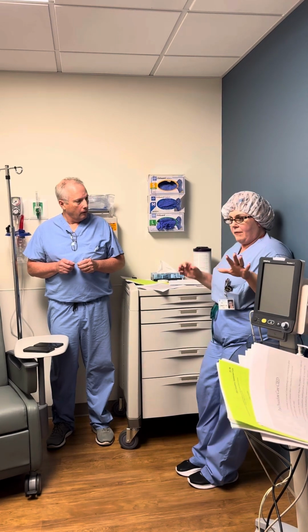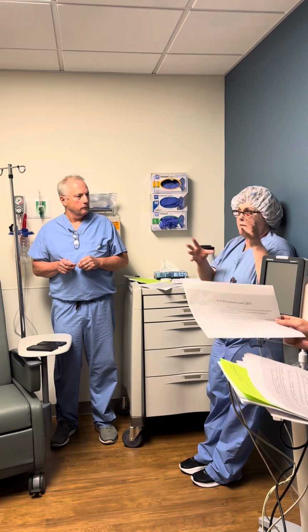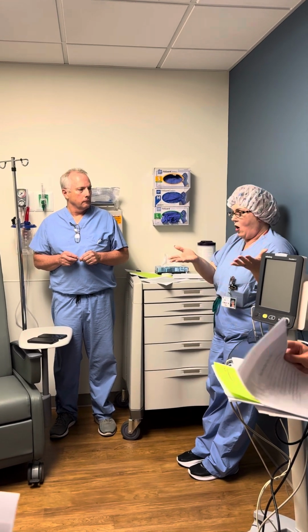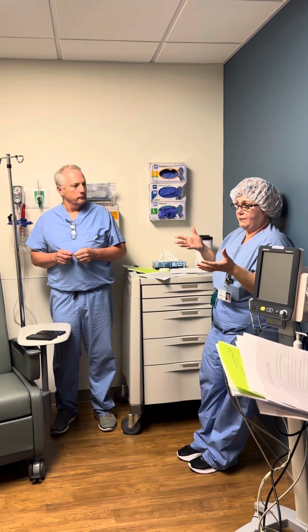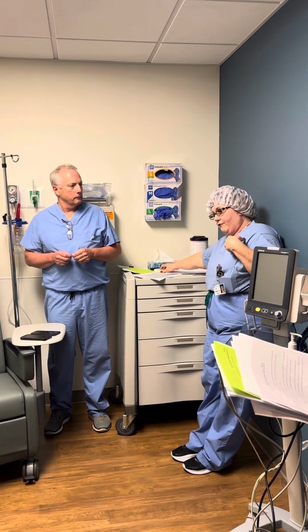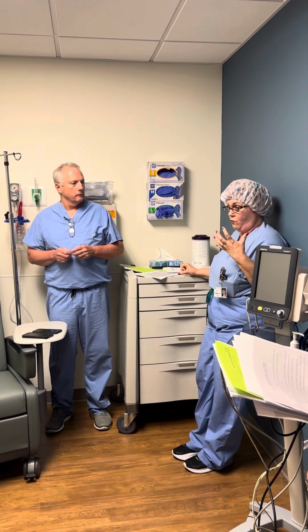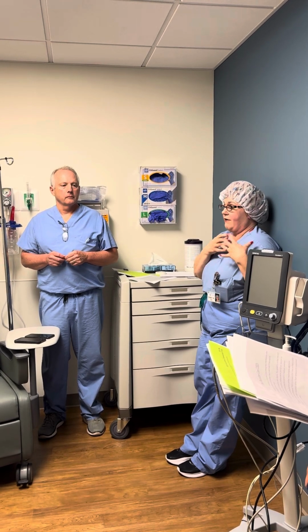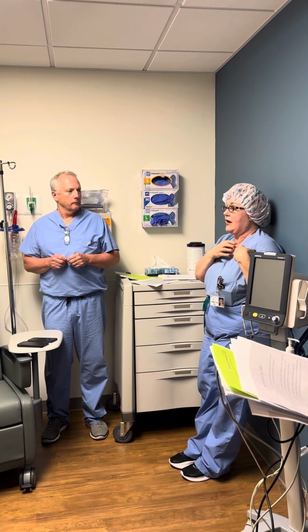Anytime these patients are going to be done, they should be on a monitor, and pre-op should be monitoring their rhythm the entire time. When we take them back to the OR, anesthesia is going to be monitoring them the whole time, and when they go to recovery, they need to continue to be monitored until it's deemed that they're okay. If we've used a magnet and placed it and taken it off, we need to make sure that it's working appropriately. Most of the time, they don't need to be interrogated, but if it doesn't seem to be functioning appropriately, we need to contact somebody to come in and interrogate the device.